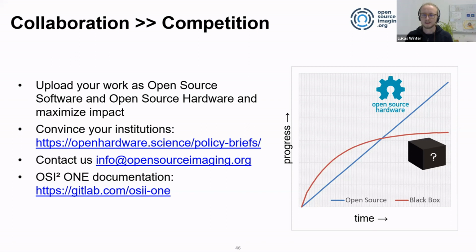And if it's made in a way that you don't need the expertise and it's just a push-button system, there's a lot of information that you can gain that is currently not in the healthcare structure because it would cost too much money, too much effort. But it could be established with these cheaper systems, and then if you still need a higher resolution image with more information or other techniques, you can still go to a better MR system. But it doesn't have any radiation or any other side effects.